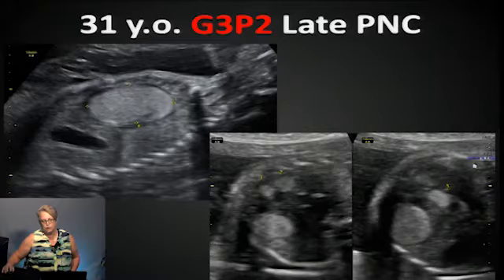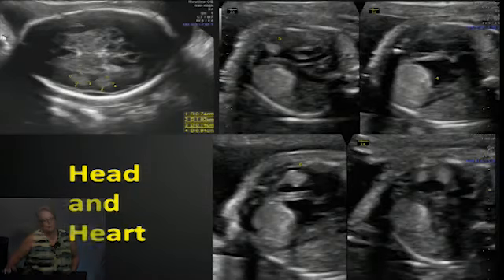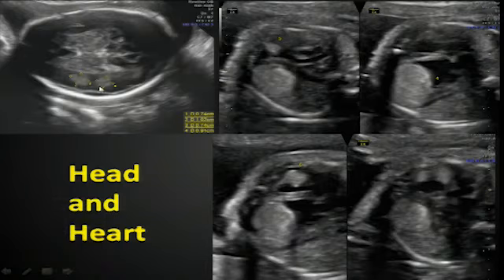Now this is a transverse of the chest. Stomach is here and then up into the heart. So we see a lot of these little bright areas. We look up into the head. I see some bright areas. And then looking at the transverse of the chest again, looking from left to right.